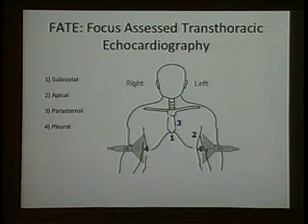Apical views are nice because they're classic. You see the 4-chamber view, and that's actually very easy to understand. It's a little bit trickier to do, and I'm going to show you some of the tricks. And again, it helps a lot when you get a good one.